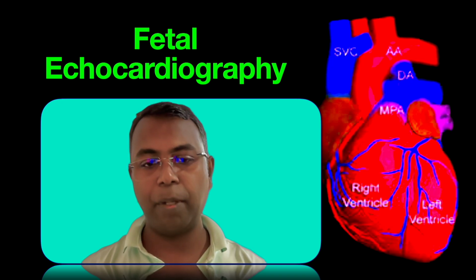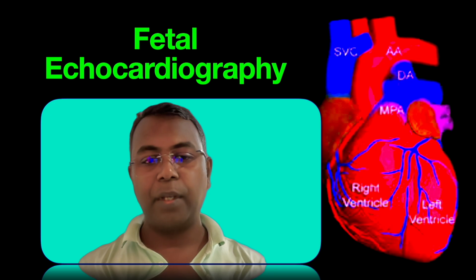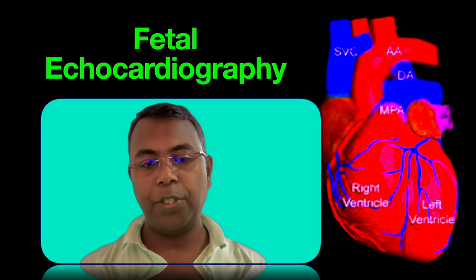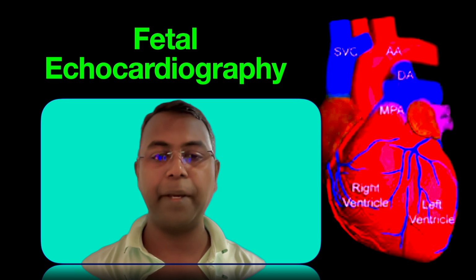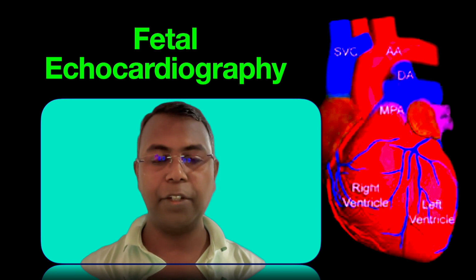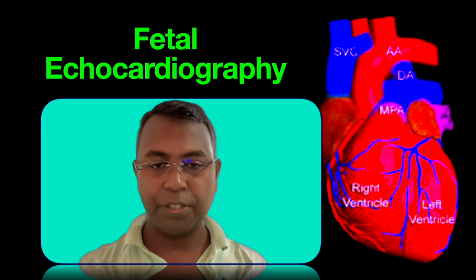Then we look at the pulmonary veins mostly in color and grayscale, and we also need power Doppler to establish the normal right subclavian artery in most of the instances. However, with normal color Doppler also, by reducing the PRF, we can see the normal right subclavian artery. So let's start.